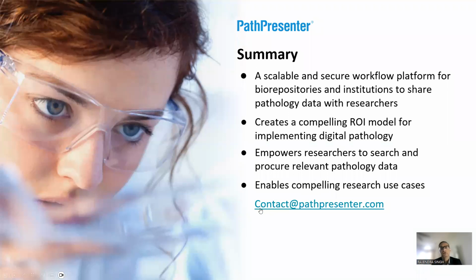So in summary, what we are trying to create is a scalable and a secure research platform for biorepositories and institutions to share any kind of pathology data with researchers from anywhere in the world. This allows the institution, the organization of the biorepository to create a compelling return of investment model for implementing digital pathology, because now they can share the data in a very secure way with researchers that have been authenticated and with any other industry partner that has been authenticated. And thus providing a compelling research use case for the data that they have digitized over the period of years.